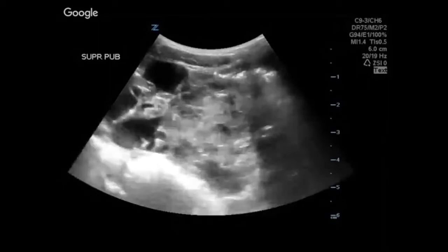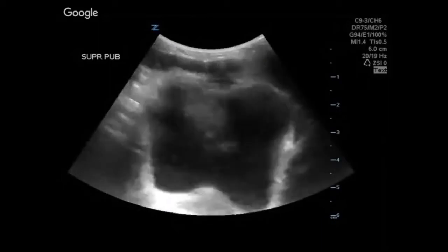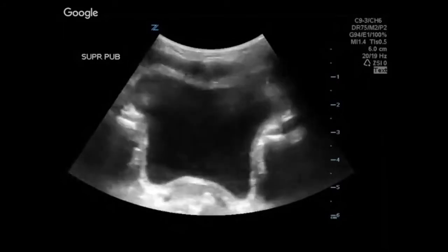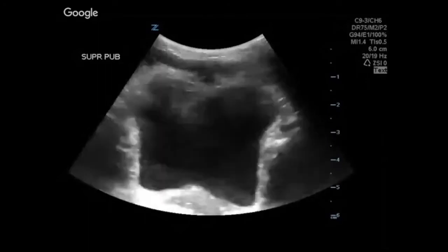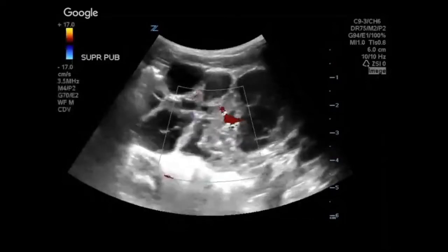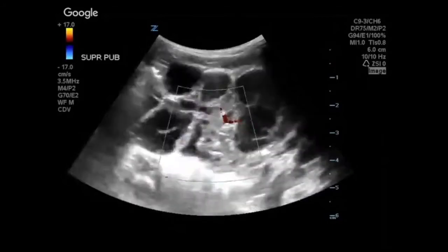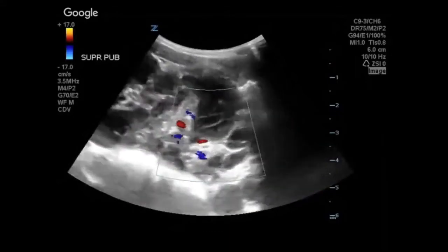And here is another lymphatic malformation close to the bladder, yeah. As opposed to ovarian cysts. It looks kind of similar, but it's not, obviously, because it's midline. And then you put flow on it, and that's how it looks. So you have the flow around, but nothing in the structure. So it's not an AVM, but it's a lymphatic malformation.